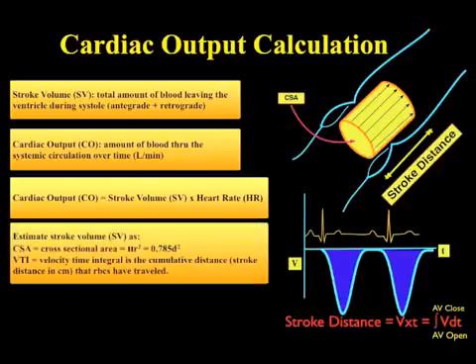The stroke volume can often be assumed to be the volume of blood leaving the left ventricular outflow tract. The outflow tract area can be assumed to be a cylinder, the area of which is the cross-sectional area times the height. The height of the cylinder is defined by the velocity time integral, a measured value obtained via pulse wave interrogation of the LVOT in the deep transgastric or transgastric long axis view.